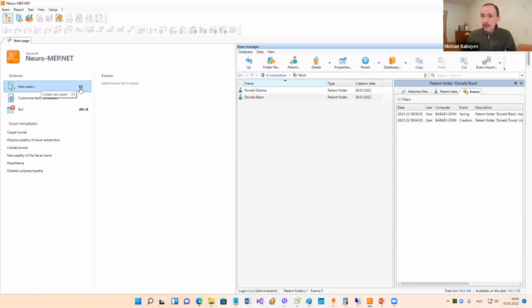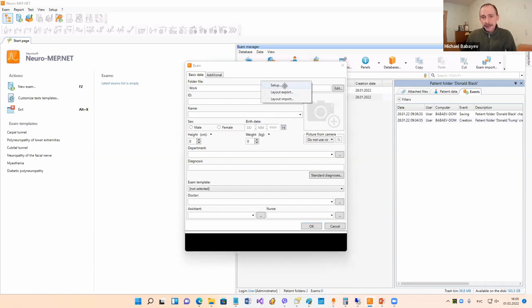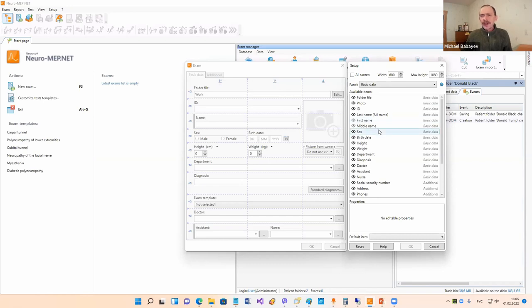You can also press the F2 button on the keyboard, or use the menu command Exam > New. We click here and now we see the exam window. It's necessary to input patient data. This window is fully customizable - it's possible to change the fields that will appear here. You can add some fields, remove some fields, change their size, and so on.